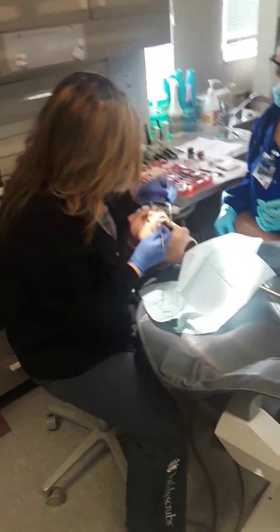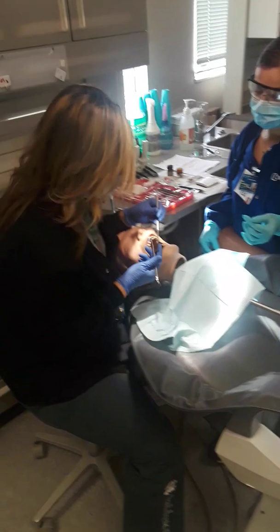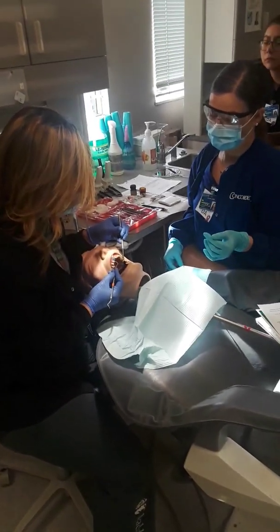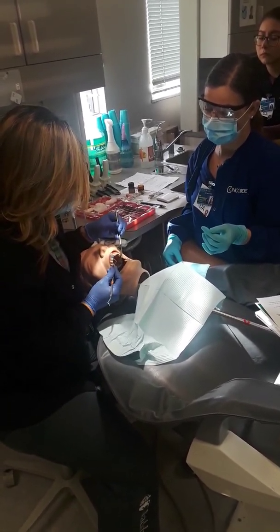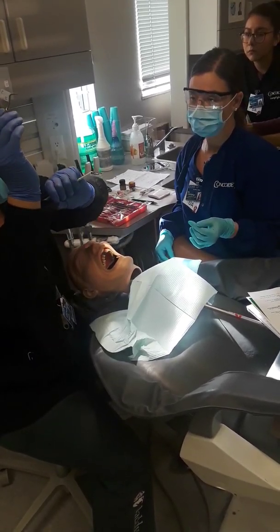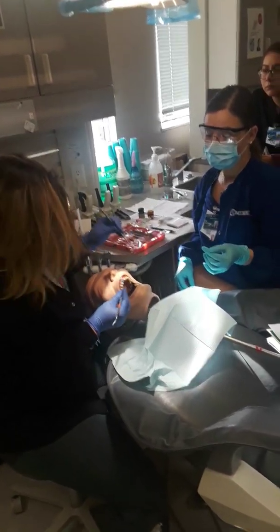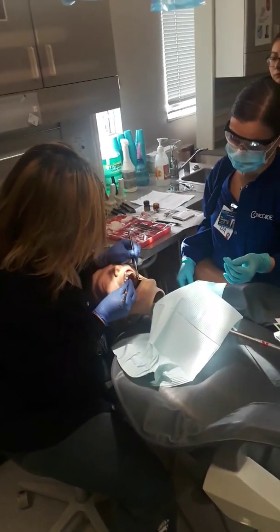This process takes a few minutes for the doc to pack the cord in the sulcus. Sometimes the sulcus is super tight. Sometimes you'll see gingiva stick out like that, and then it makes it really easy because that's bad, unhealthy gingiva. So it just depends on what your patient has.